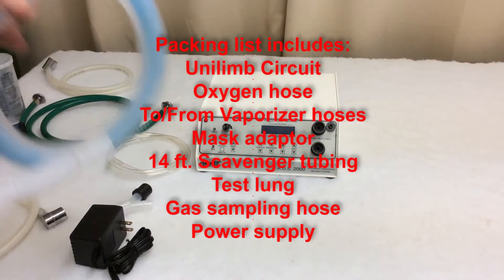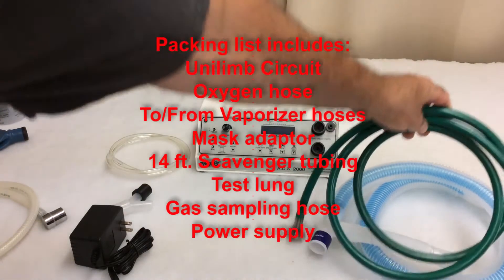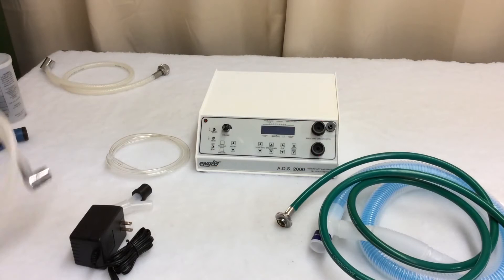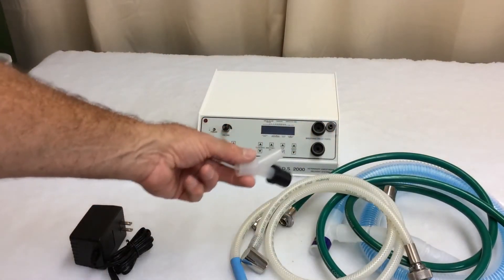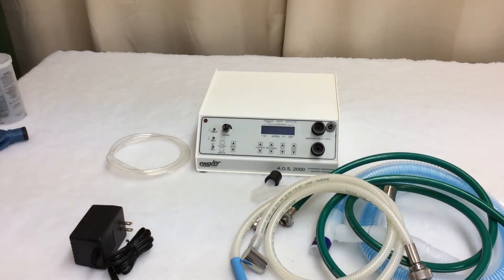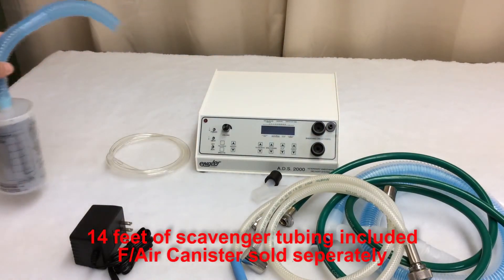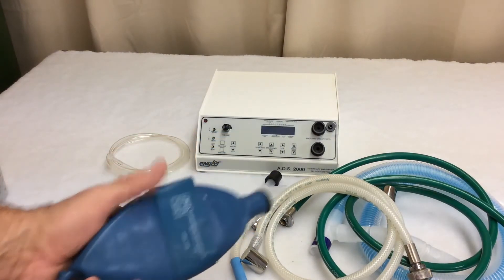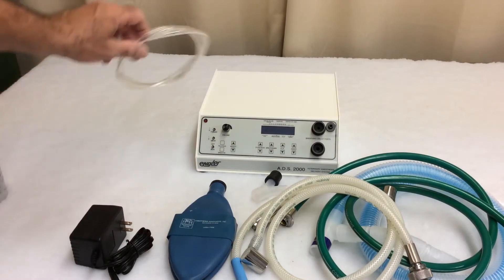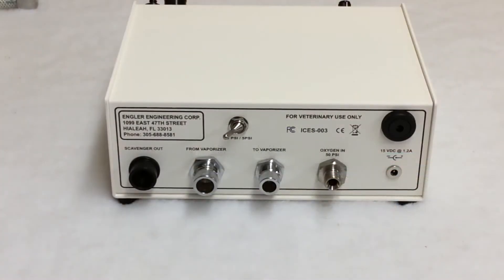Let's start with the Unilimb Bain circuit that's included. The pretty standard oxygen hose. To and from vaporizer hoses — these are silicone vaporizer hoses. A mask adapter, which will allow you to mask your patient down. We normally offer 14 feet of scavenger tubing; for this video, I'm going to be using a shorter piece of tubing with an F-Air canister just for display purposes. We offer a test lung, which allows you to practice before you use the ADS on an actual patient. We have the gas sampling hose, which I will get into more detail later, and of course a power supply.